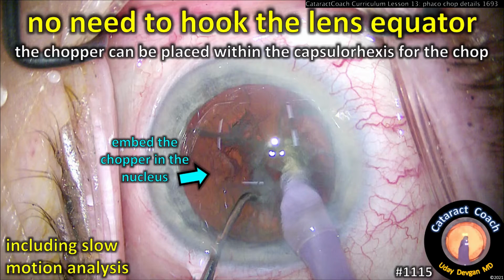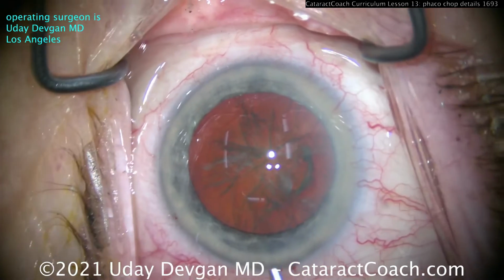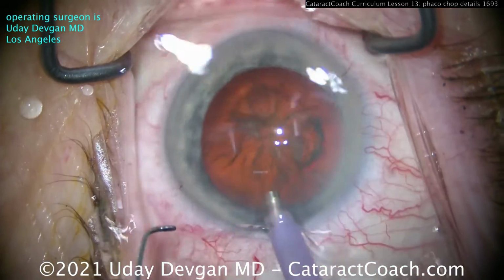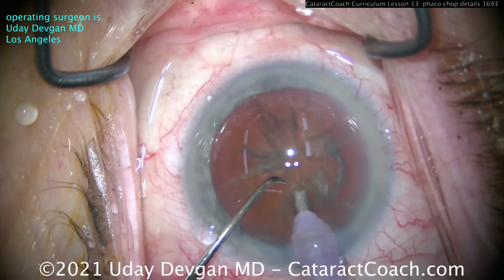There's no need to hook the lens equator. You can simply place the chopper within the capsulorhexis and into the nucleus and still achieve the chop. Let's watch it first here in real time, and then I'll show it to you in high magnification and slow motion. So place the chopper into the nucleus.